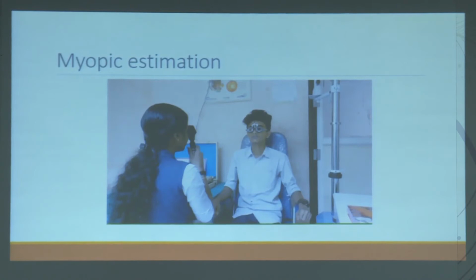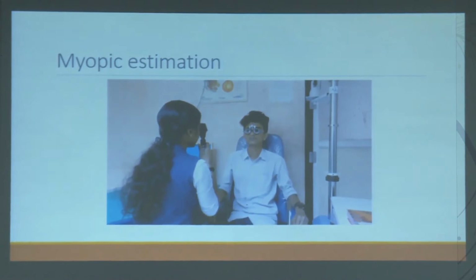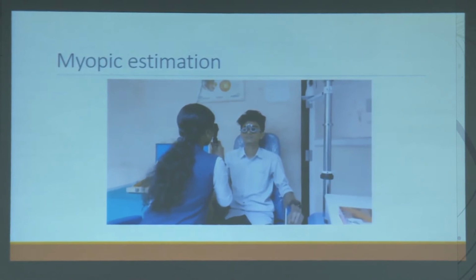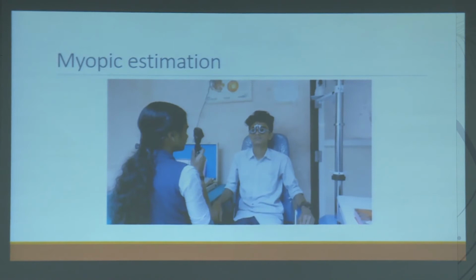So when you do the retinoscopy, suppose your usual working distance is either 1 meter or 2/3 meter. If you are seated at 1 meter from the patient and you are doing a retinoscopy, we all know that if the patient is emmetropic or hypermetropic or myopic of less than 1 diopter, you get a with movement. And if the patient is myopic more than 1 diopter, you get an against movement and you neutralize accordingly. If you are sitting at 1 meter and the patient is myopic to the extent of minus 1 diopter, even when you start, you get a neutralized reflex.